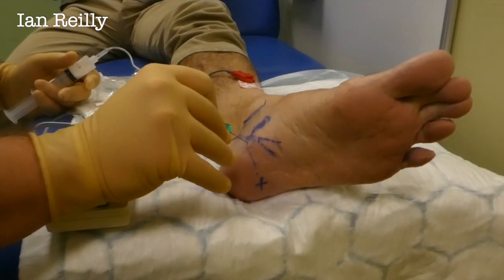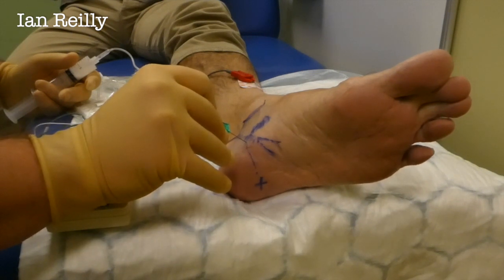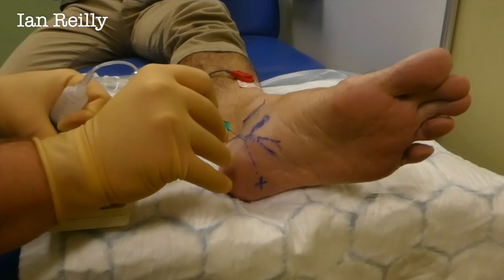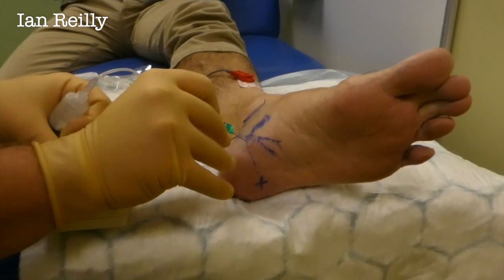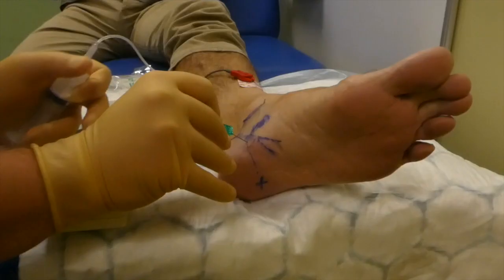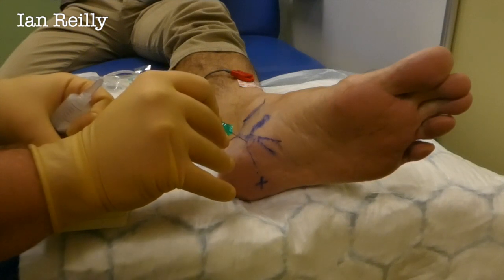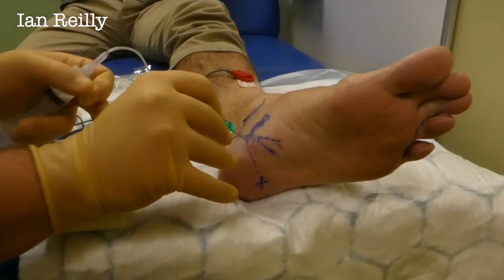We're getting it lateral — that's our nerve, absolutely. So George is calling it at five milliamps. What we're doing is taking that amperage down, because at five milliamps the voltage spreads too wide. We want a small voltage, which means we're right on the nerve — super accurate. George is turning down the gain on the nerve stim down to about 0.5, maybe 0.75, so we know we're right on the nerve while still getting just a little flicker in the toes. The nerve stim tells us where it is.